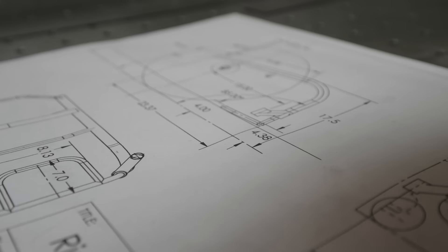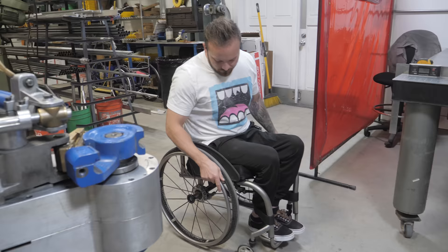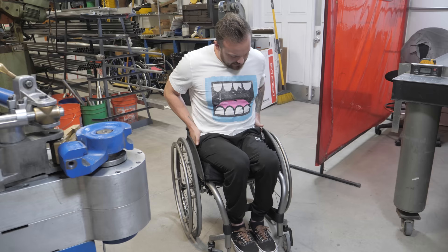Today I'm going to get measured for my new custom wheelchair. The first thing we're going to do is talk about all the things I like and don't like about this chair. I'm here with Eric, and he's going to help me through this measurement process. One of the things I've most recently realized is that I keep finding myself trying to push myself back further in the chair. I also find myself getting a little wiggly left and right — I feel like I have too much play, too much space.